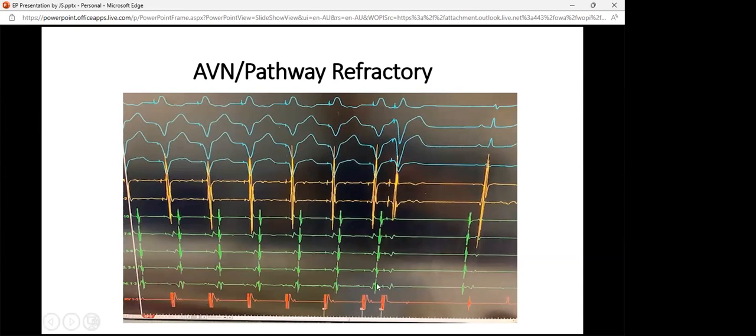And we said before that if that's the first one that's leading, then perhaps it's telling us that we have a left lateral pathway. As I pace the ventricle, the first activation in the atrium was actually the CS distal catheter, meaning that it's located right on the left free wall of the left atrium. So I was getting pretty excited to think we're probably in this instance, and it's very diagnostic of this patient having a left lateral pathway.